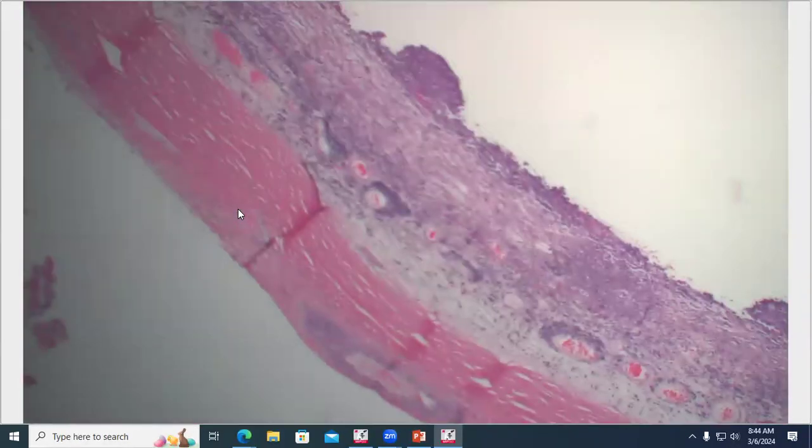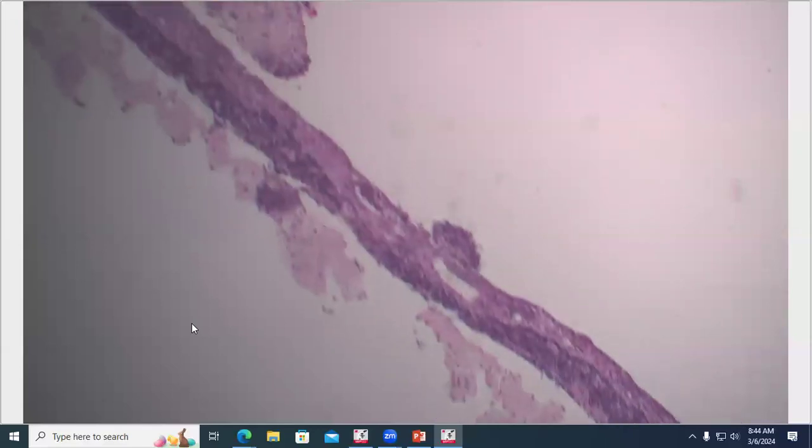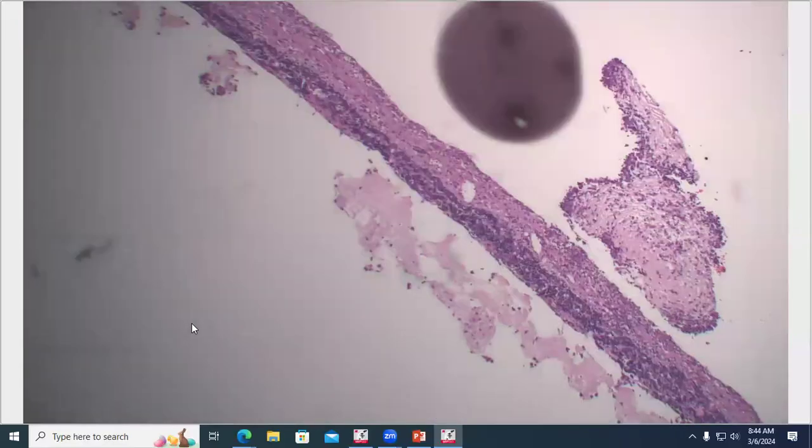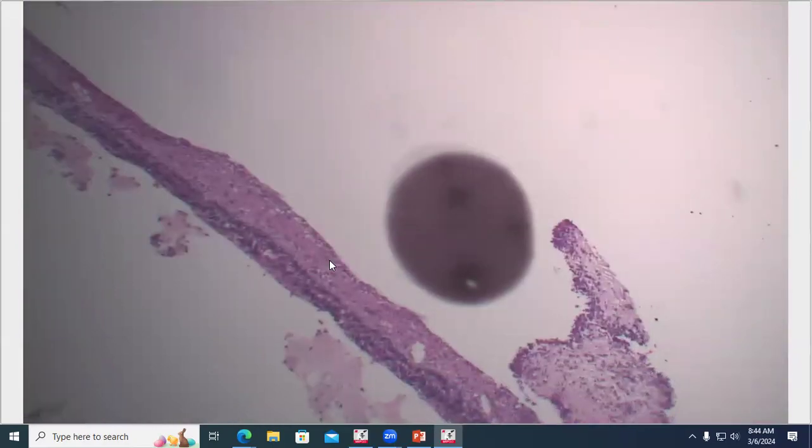And this inflammation is pretty severe, infiltrating and thickening the choroid and in the retina as well, just as they said clinically, with some fibrin and inflammatory debris in the subretinal space, and pretty much complete retinal detachment. Although maybe there are some areas that look a little bit more attached than others. The retina is also showing an outer retinal atrophy, as you might expect with a detached retina like this.